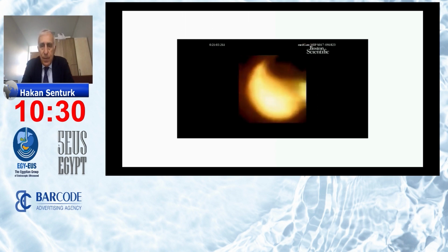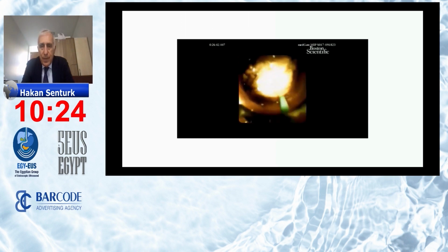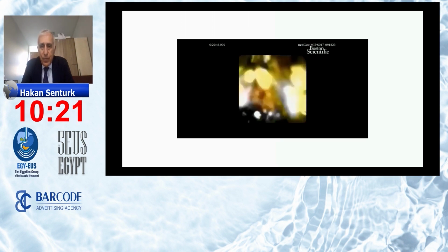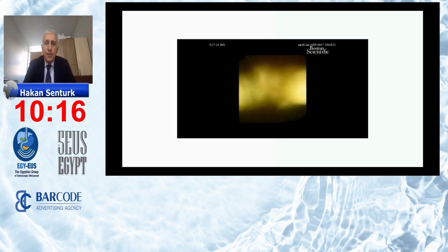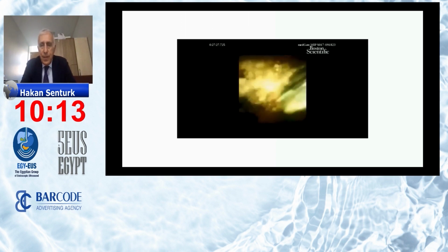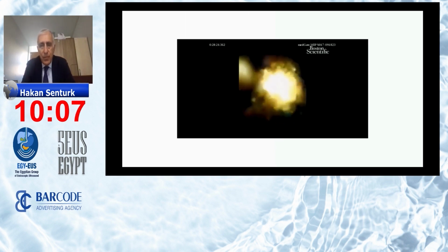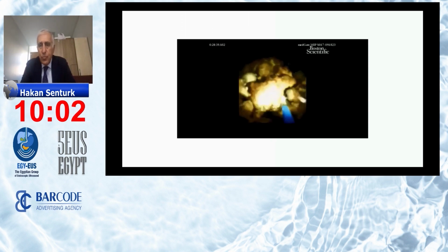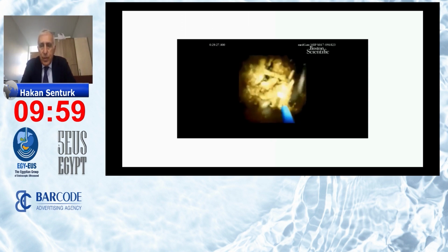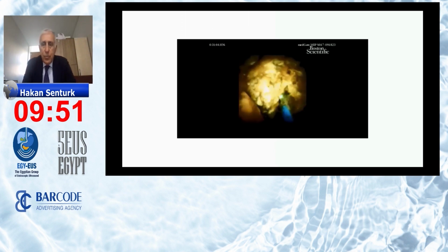We insert a spyglass into the hepatic duct, and we perform laser lithotripsy. Actually, sometimes advancing the spyglass to the desired place may be difficult. So you can go from left to right ducts for some peripheral ducts. So sometimes it may be difficult. So you take your time and you try to reach your desired point. And for this very large stone, we perform laser lithotripsy.